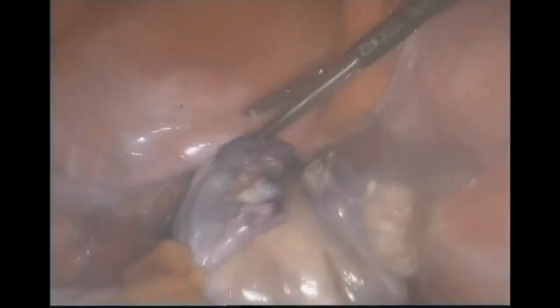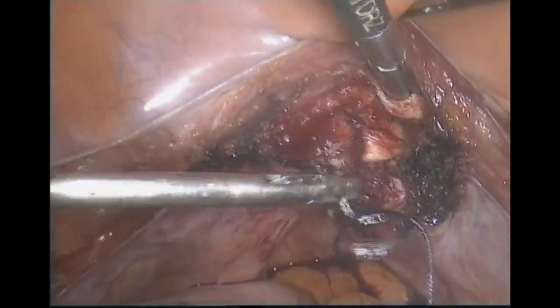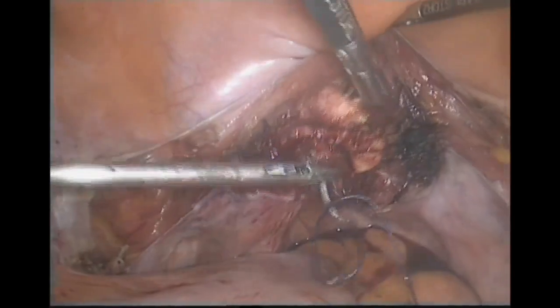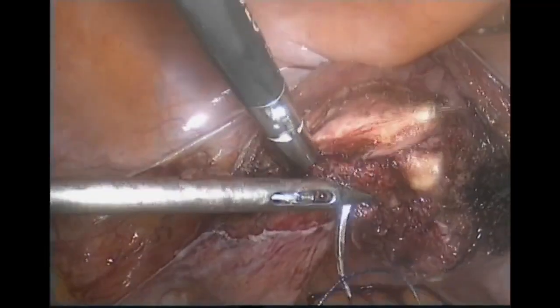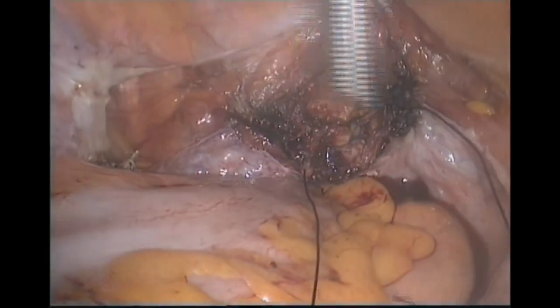Good traction. So for specimen retrieval, deliver the uterus by the vagina, toward the vagina. Easy to deliver, an easy and simple TLH. No need for any parts of the experience. Just do one, and the candidate can do another TLH in a simple manner.